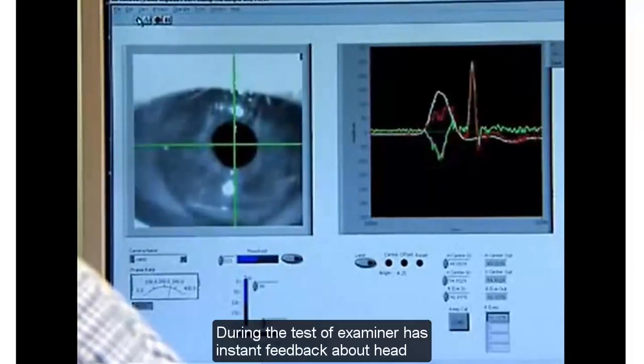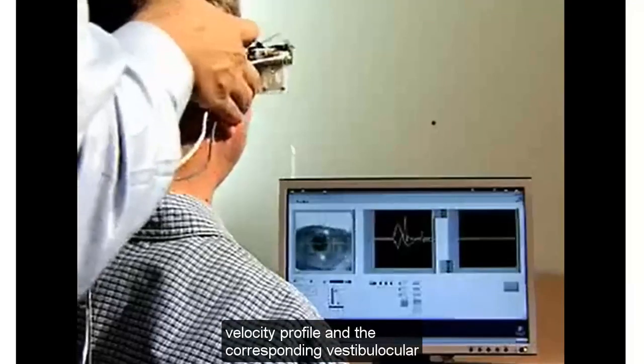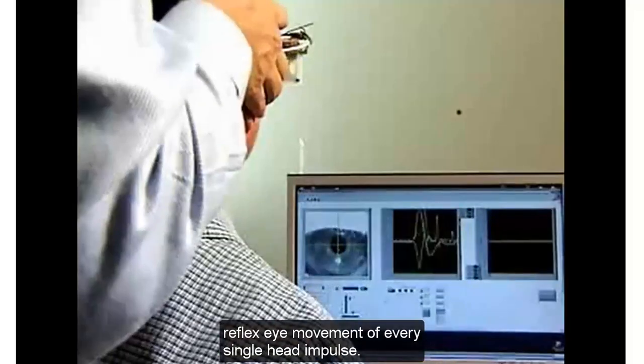During the test, the examiner has instant feedback about head velocity profile and the corresponding vestibulo-ocular reflex eye movement of every single head impulse.